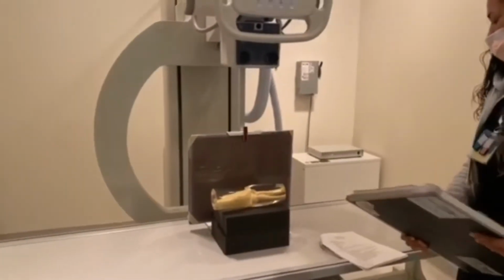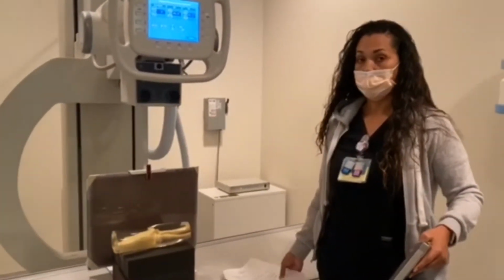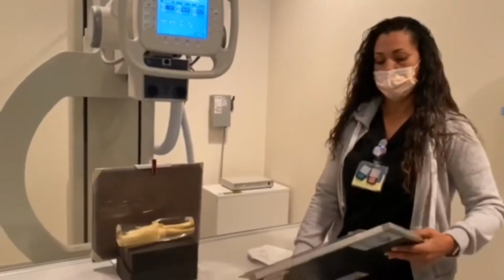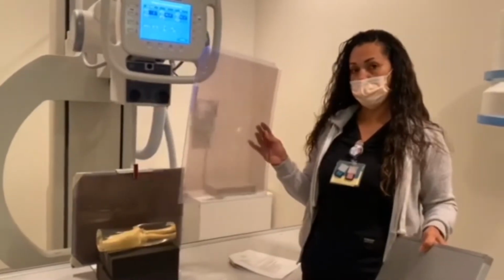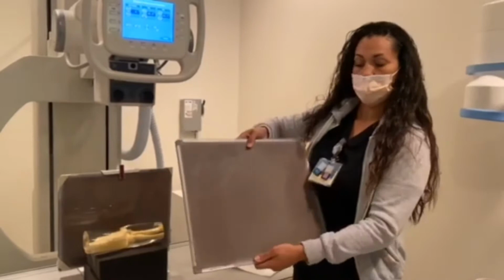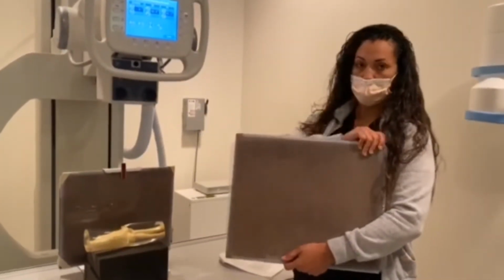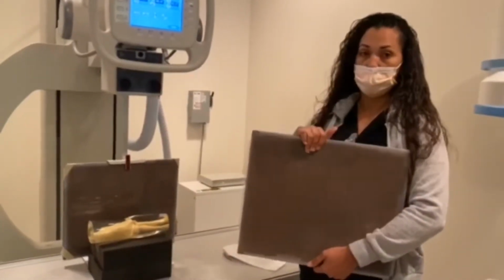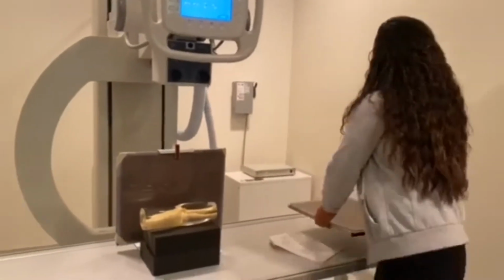Okay, so for this lab, in room 1, we're going to be demonstrating how different body part thicknesses affect scatter. So what you're going to do is get a 14 by 17 and a wire mesh tool. Place the wire mesh right on top of your 14 by 17 and tape it in all the corners so that it's nice and flat and flush up against your IR, okay? Well, I already have one set up here for you.